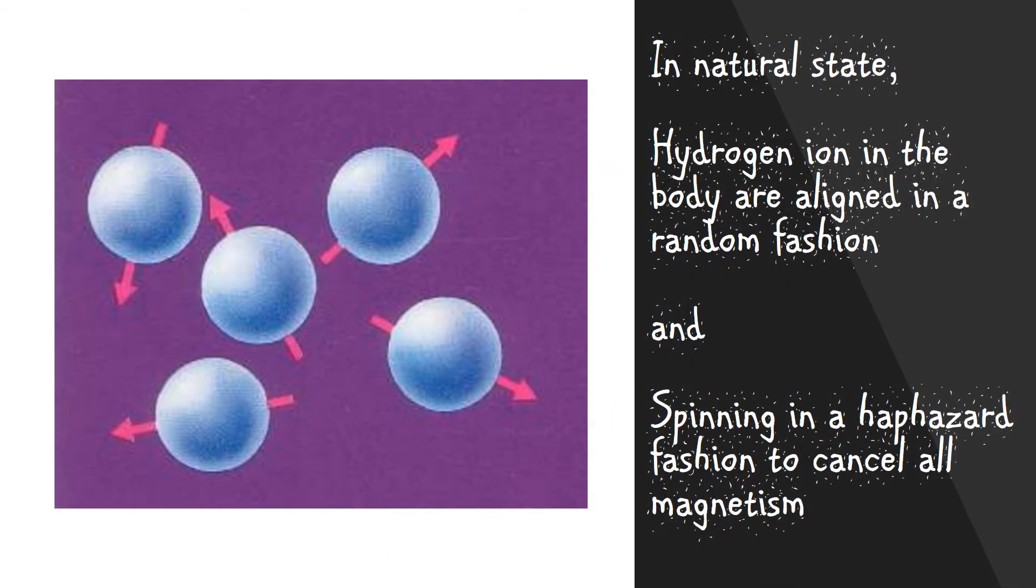In natural state, hydrogen ions in the body are aligned in a random fashion and spinning in a haphazard fashion to cancel all magnetism.